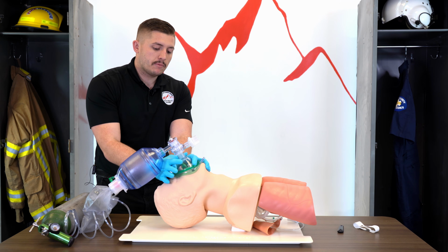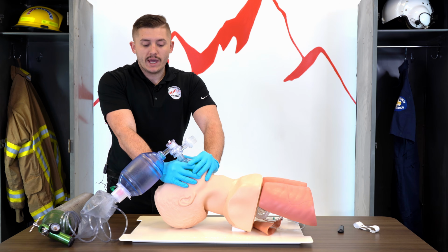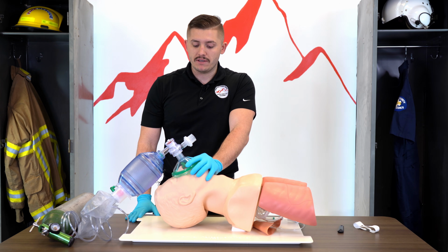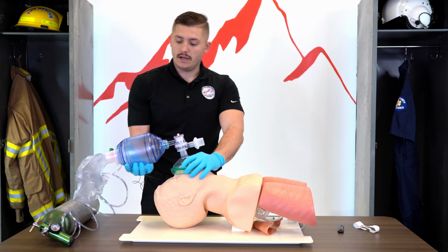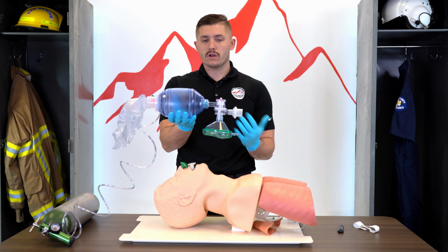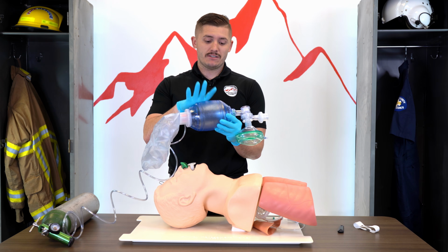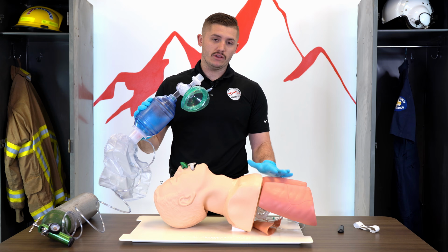In the field, what we typically tend to do a lot is one person will hold the seal with 2 hands while our partner is delivering a breath with the BVM. When delivering a breath, these new BVMs that have come out, you guys might see bigger BVMs wherever you work or you might end up working, are typically about 1,000 cc's. This BVM right here is about 500 to 600. This is the perfect amount for our lungs.